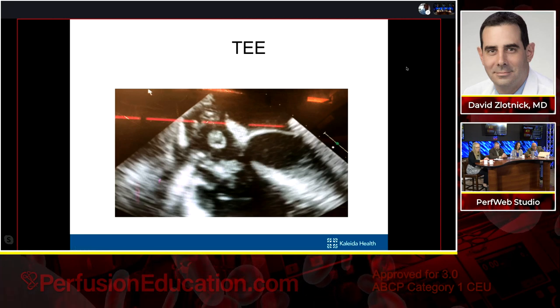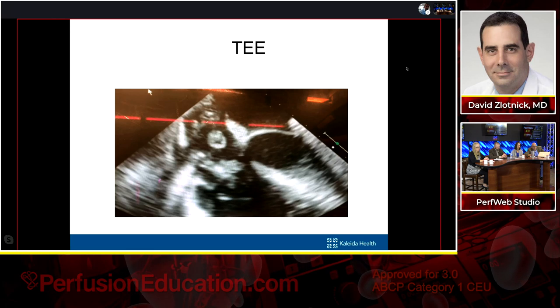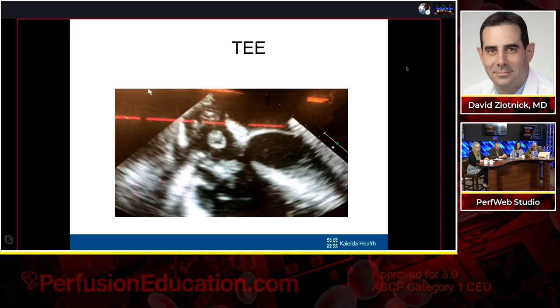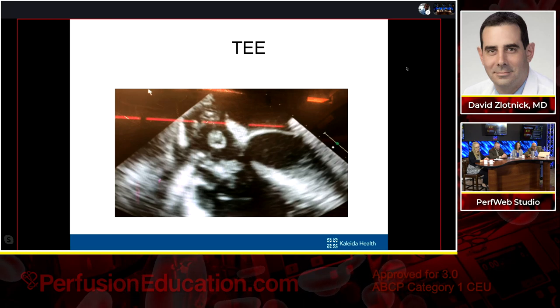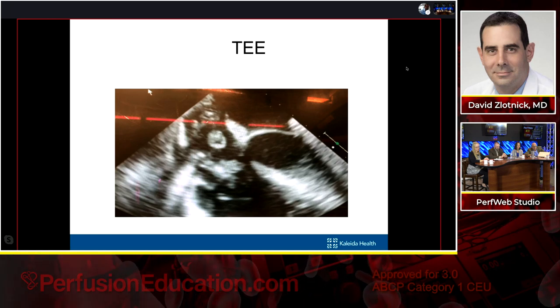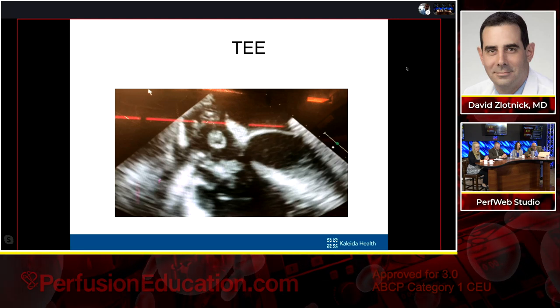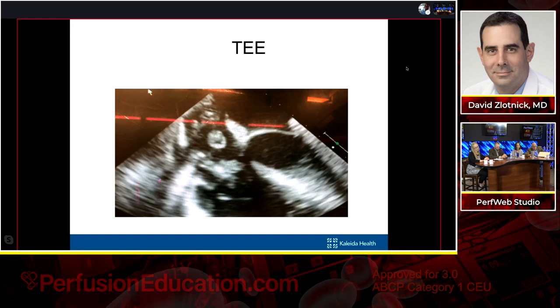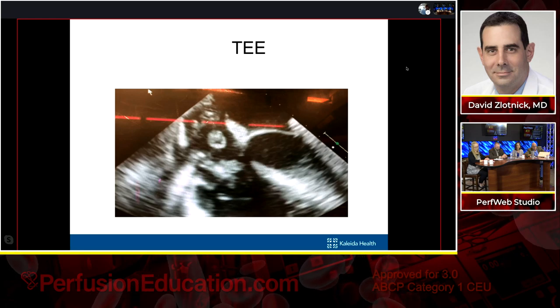So again, we got a multidisciplinary team together, and we took a look. Though he was a young kid, the mitochondrial disorder was almost mimicking a neuromuscular disorder, so we thought he would be a little bit higher risk for recovery after a sternotomy. And so what we decided to do was an AngioVac-assisted laser lead extraction in this patient. And I'll walk you through the procedure.